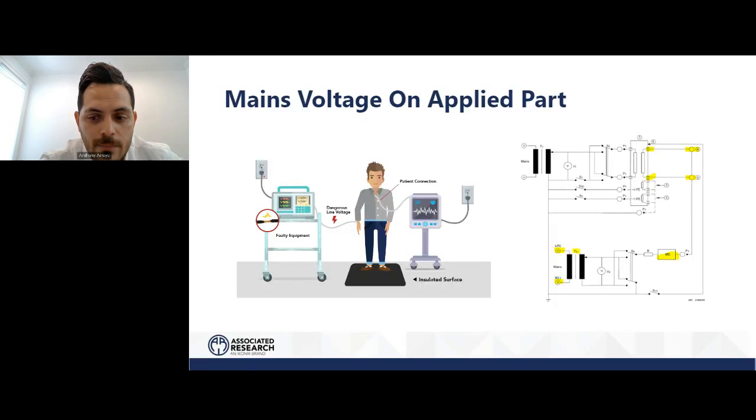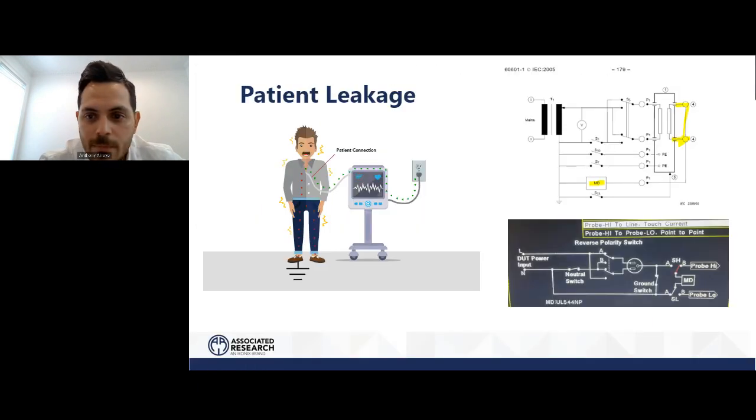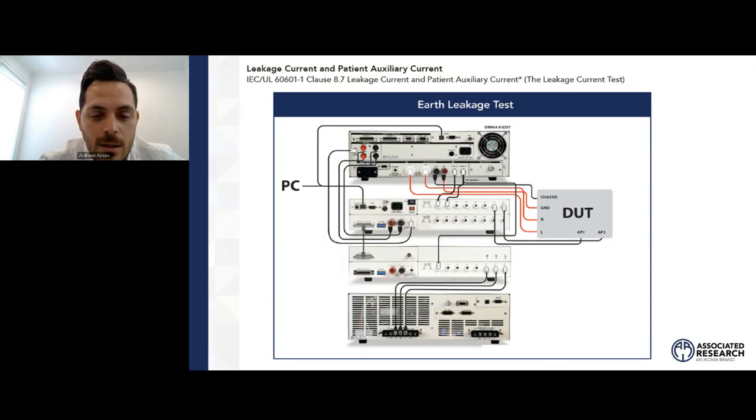Okay, so we're about to jump into, no, actually, patient leakage, right? These applied parts, literally the same thing I just discussed. I've sent an applied part to a scanner channel. I have my probe high to that same scanner. All right, short channels make both channel 1 and 7 high.